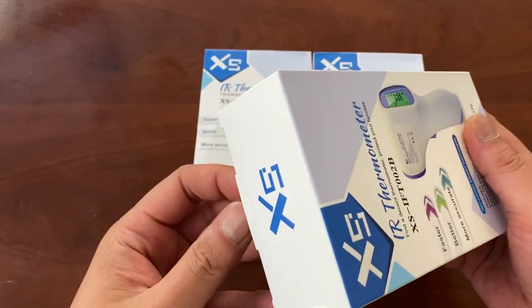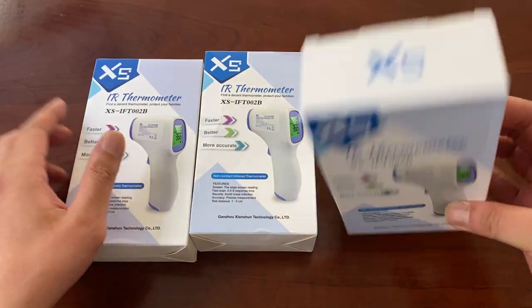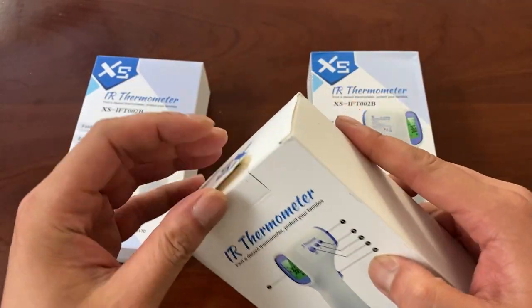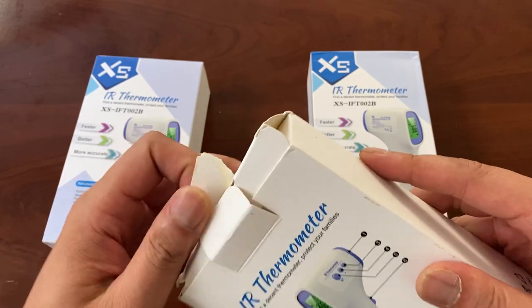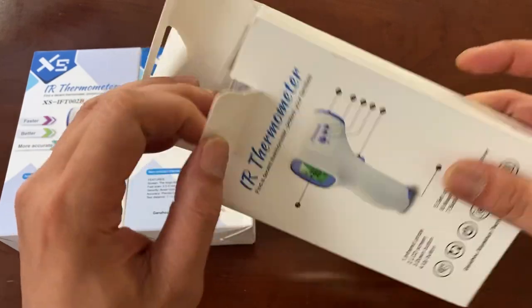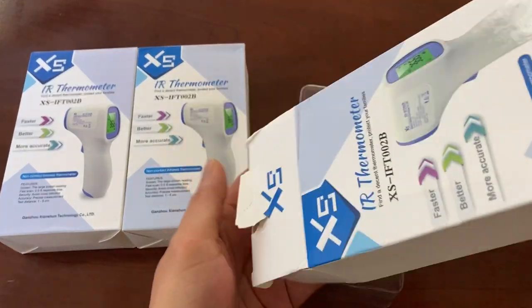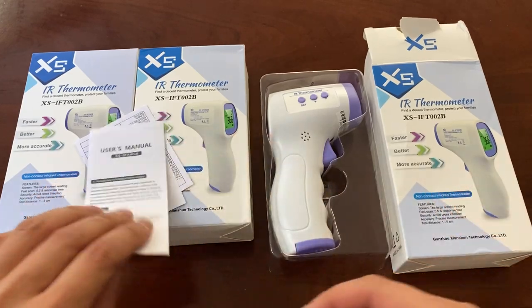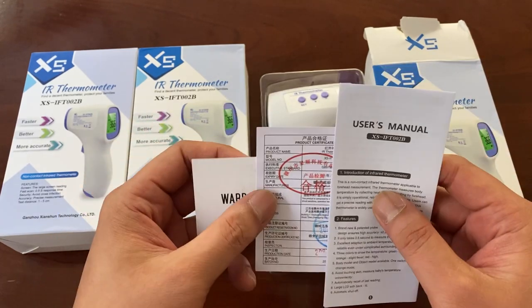As you may well know, many of these instruments that you find online are not really made for the American market because of the measurement systems they use. By default, this unit is actually set to read Celsius temperatures. As you know, we here in America use Fahrenheit. But that's pretty simple to remedy — you can actually set it up to read in Fahrenheit.